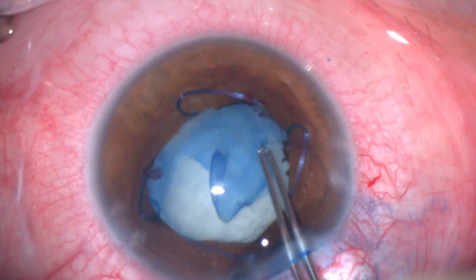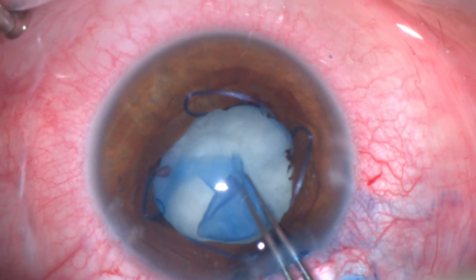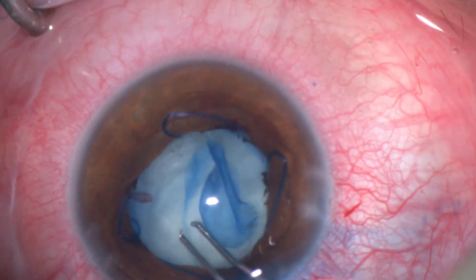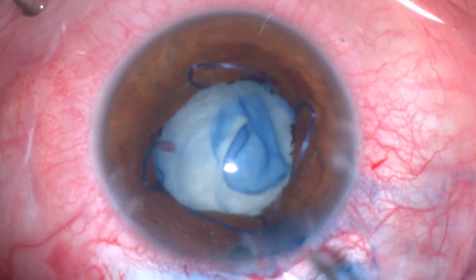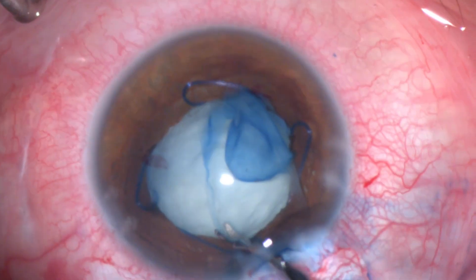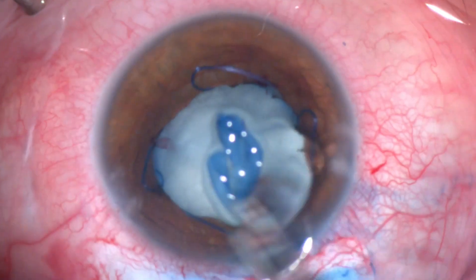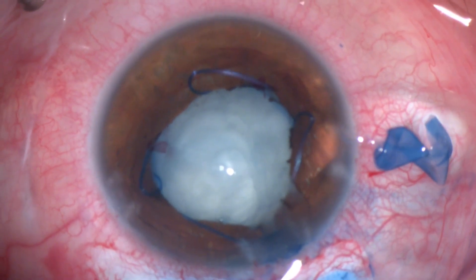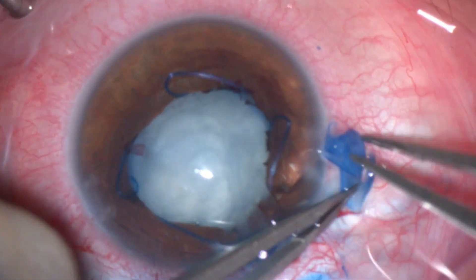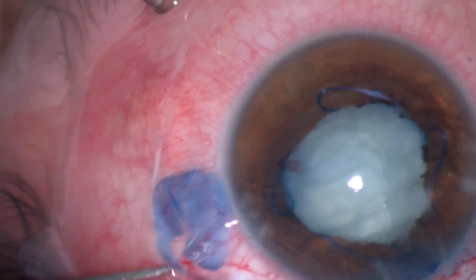Gradually spreading the capsulorrhexis in repeated small maneuvers, slowly bit by bit extending it to complete a decent size capsulorrhexis of about 5.5 millimeters. There was a small tag at the end which I removed with scissors. Once the capsule was completely freed I placed it on the surface of the eye to confirm the capsulorrhexis is complete.